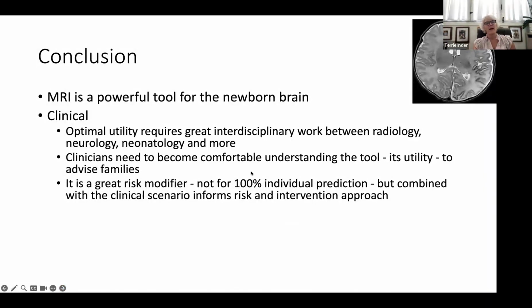You need to be comfortable really to apply the tool based on the clinical context and the question you're asking of the scan. It's a great risk modifier, but it's not 100% for individual prediction, because it's going to combine with the clinical scenario, and it's going to combine with whatever you're going to do to try and rehabilitate that brain.